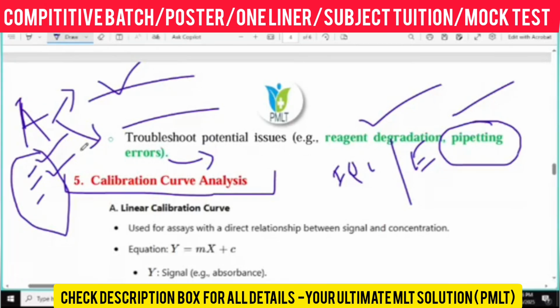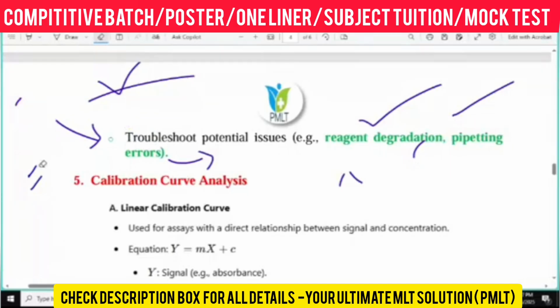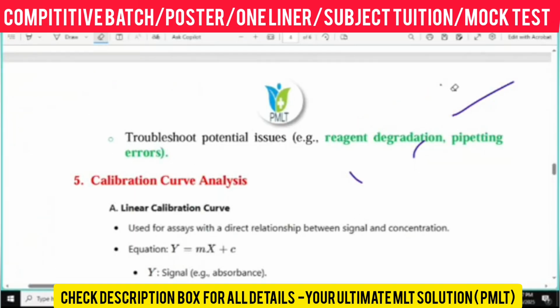Okay, up to this much, anyone have any doubt? Up to this much, we have understood what a calibrator is, what a standard is, what a control is. Anyone have any questions regarding these things? After that, we have understood the types of calibration, right? One is based on the purpose, another is based on the sources. Under the purpose, there is primary and secondary.